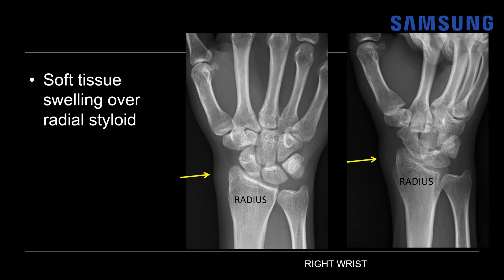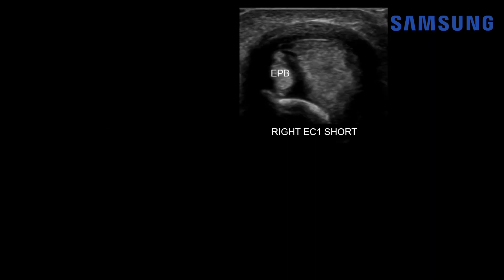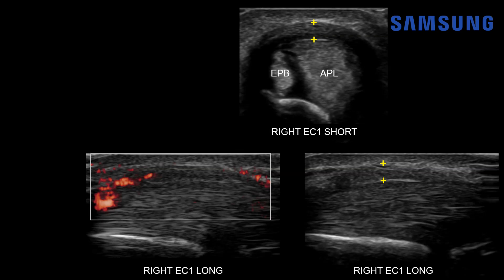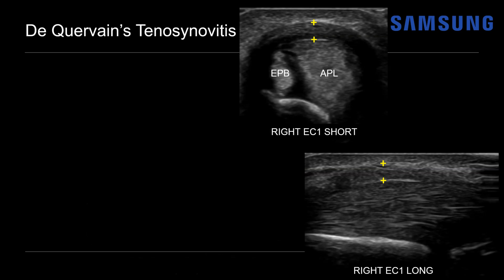If we put the ultrasound transducer directly over this region in short axis, we can see the EPB tendon, the APL tendon, the underlying radius, and a hypoechoic thickened extensor retinaculum overlying these tendons. On long axis, we see similar findings: that thickened extensor retinaculum, the underlying tendon of compartment one, and the distal radius. When we add color Doppler — microvascular flow — there's some mild hyperemia about that retinaculum and tendon. This is a typical appearance for Dequervain's tenosynovitis.